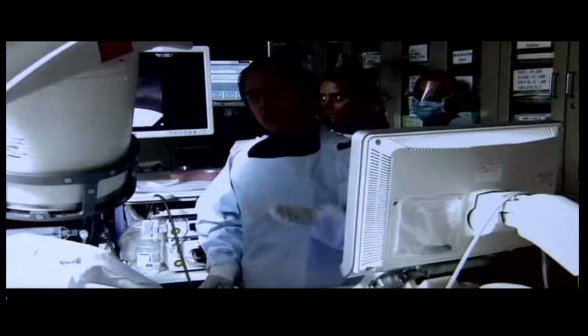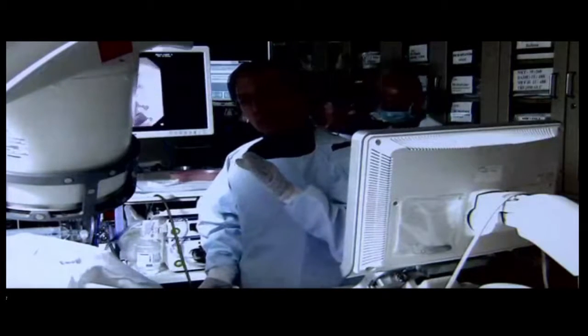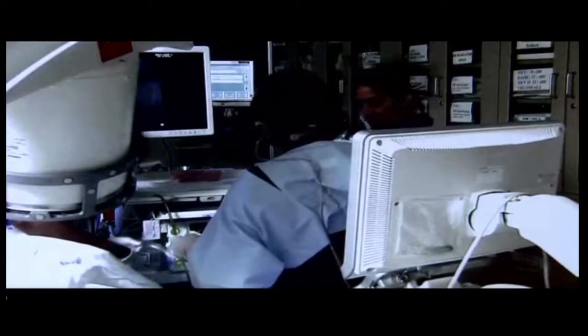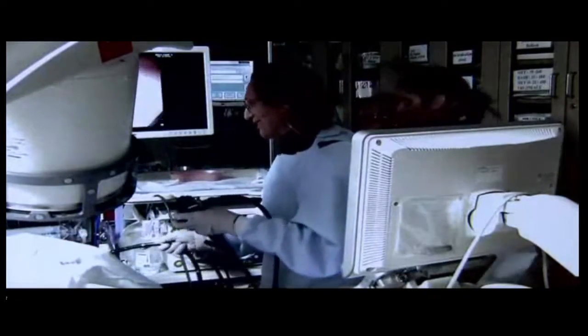We found that very useful because we do all of our glue and we use coils as well. Our coil gluing of gastric varices, we did that previously with the forward view scope. That scope then was just a prototype under evaluation, and now we're getting that back again because it has the advantage that when you do have some bleeding, you can very quickly wash away any blood. Is it ready? Yeah. Okay, all right. So it looks like we won't be using the forward view.